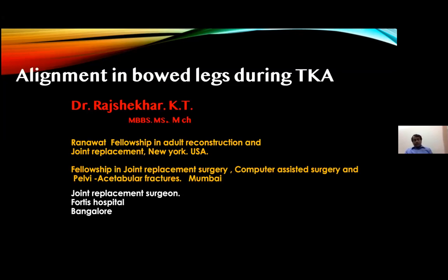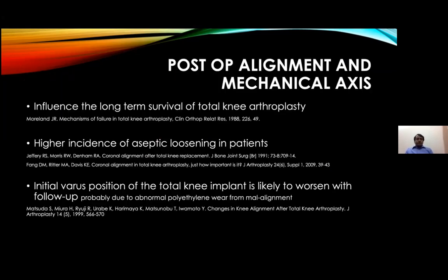So how to get the proper alignment? Unless you have navigation in your center, or other techniques you can use. But if those things are not there, at least I can just share my experience and you can make use of this and you can get good alignment. So the post-op alignment is very important and there is enough literature and everyone is aware of this. Otherwise, if the alignment is not good, this leads to aseptic loosening of the tibia.